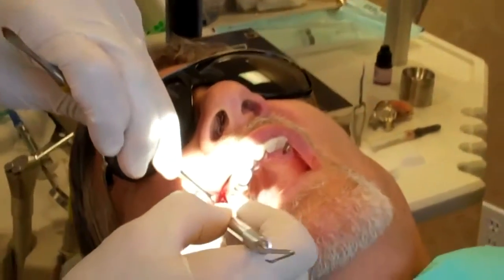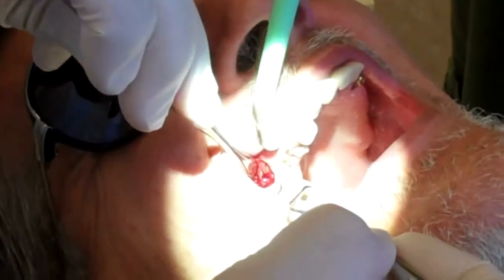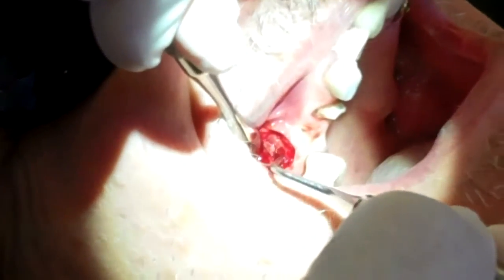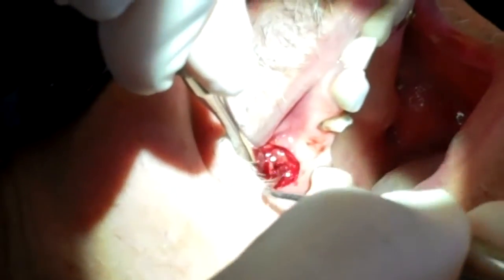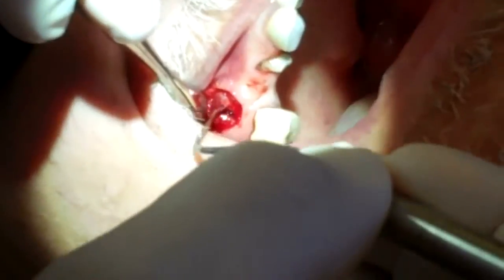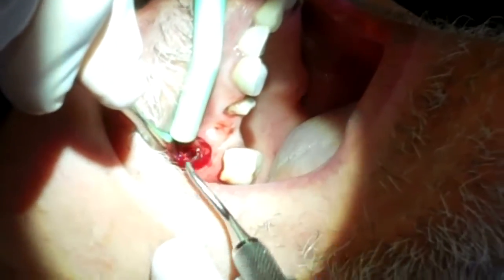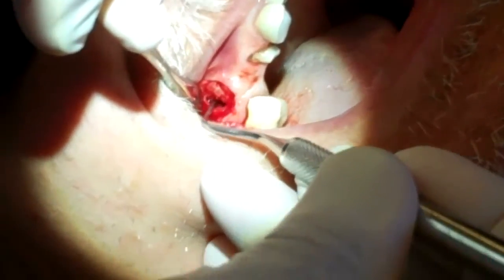This is the area right here that we're working on. This tooth has had a root canal a number of times. Right in here is where we made what's called a flap, and we can see this is all soft, and this is actually an infected area. So we're going to clean this out. I have Doug plenty numbed up, and we're going to clean up all this infection that's created chronic problems for him, and then go from there.